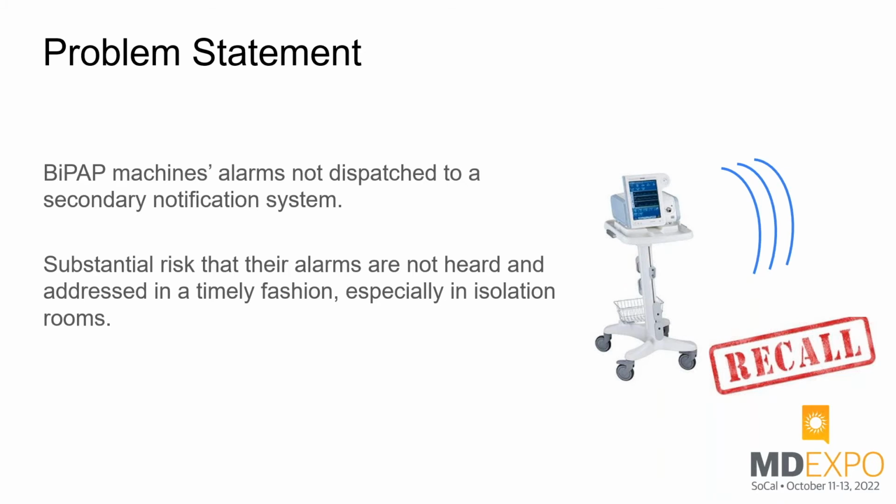Are you leveraging the nurse call as well? Yes. We're doing a couple of things. Well, we're doing it for that recall, of course. So we're doing the nurse call, and we're doing it in another way. We're actually on our ventilators in one unit because it's hard to see. We got it tied to 2 systems to do alarm one way, but also keep track of it another way. So it's a little confusing.